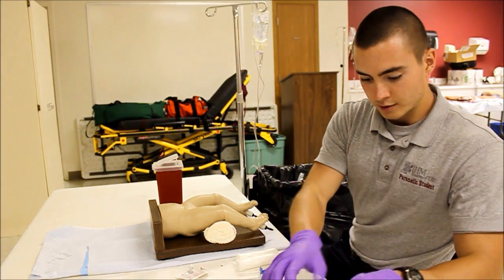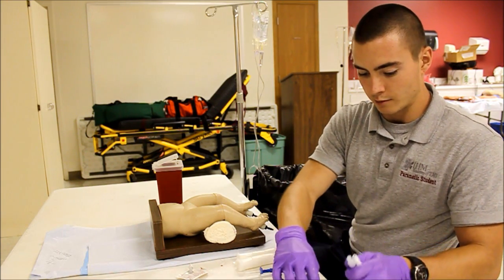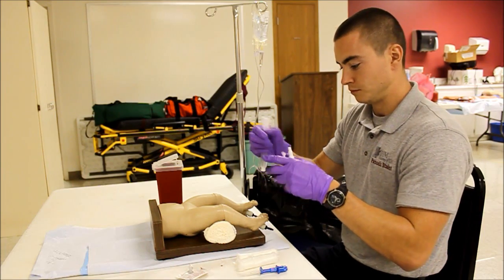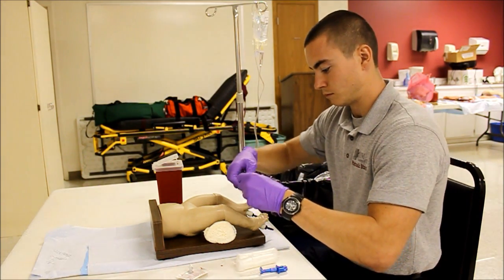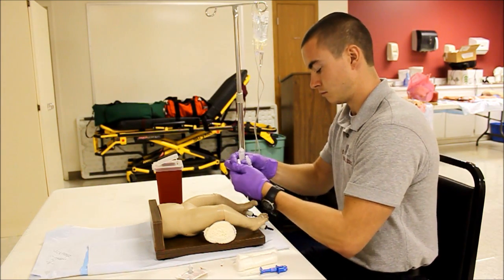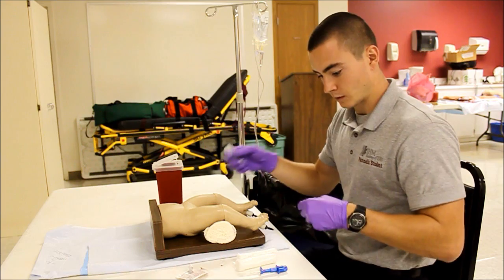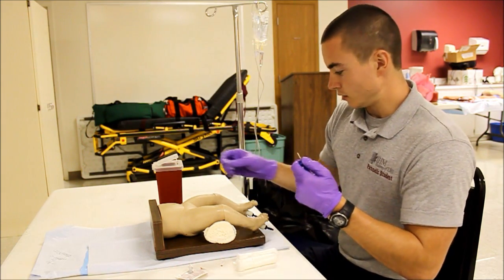After my site is cleansed, I'm going to go ahead and prepare my equipment. I'm going to flush all the air out of my stopcock. I'm going to go ahead and prepare my needle and remove the cap.